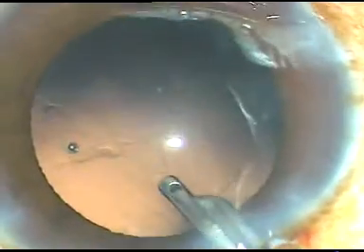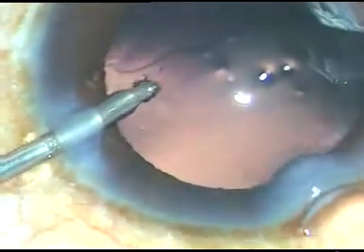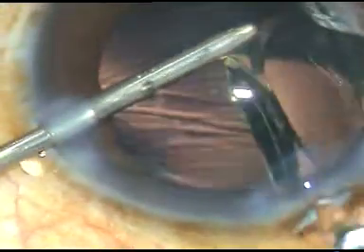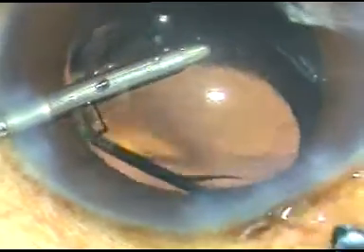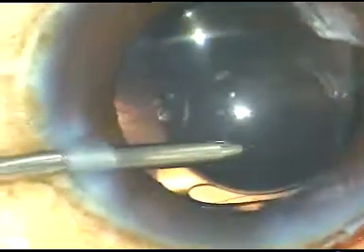In this case, we have selected a hydrophobic acrylic intraocular lens. I have decided to implant the lens under irrigating fluid — this means the irrigation will keep the anterior chamber formed. The irrigating probe has been introduced through the left side port and the IOL is injected into the anterior chamber. The leading haptic didn't go into the capsular bag; the trailing haptic has been placed in the capsular bag.